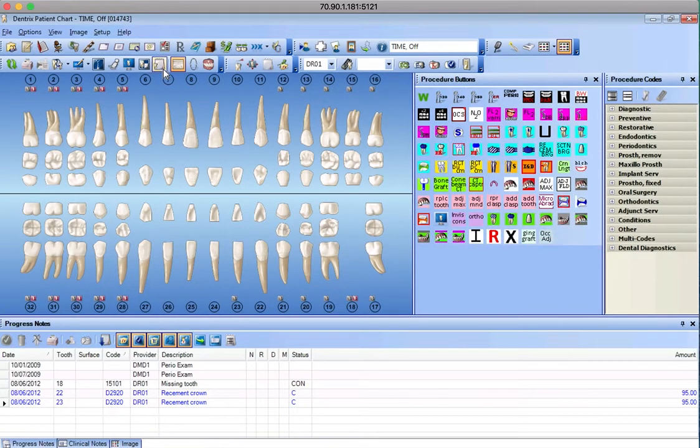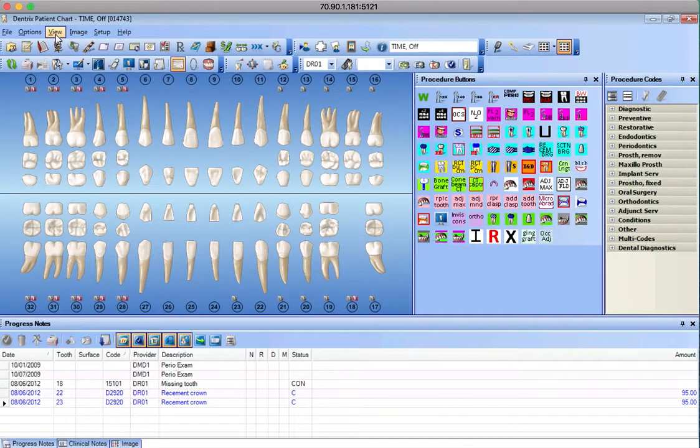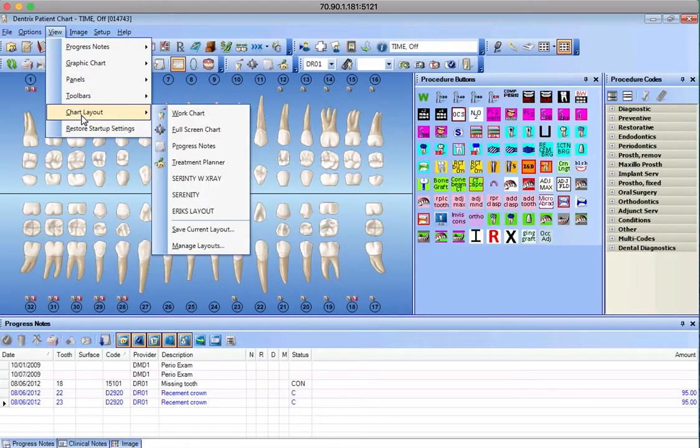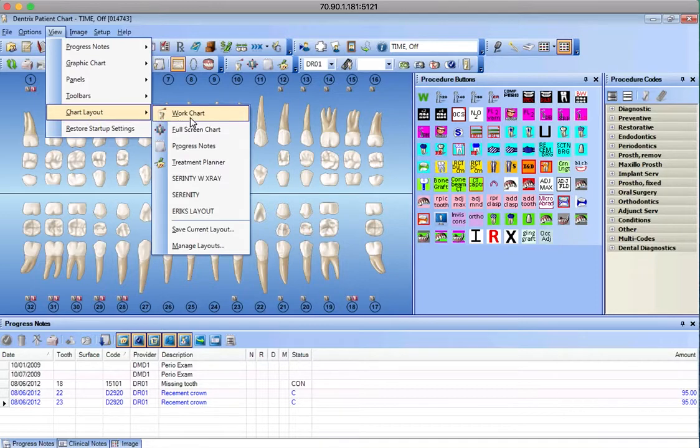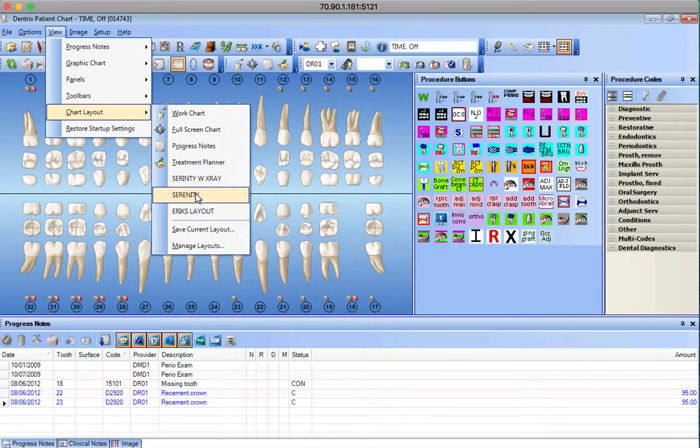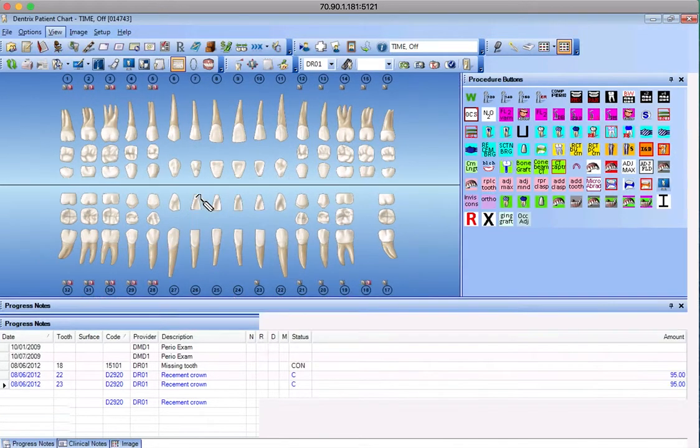You also then go to View, Chart Layout, and we have a couple different views. Pretty much you're gonna always pick, for at least now, Serenity.